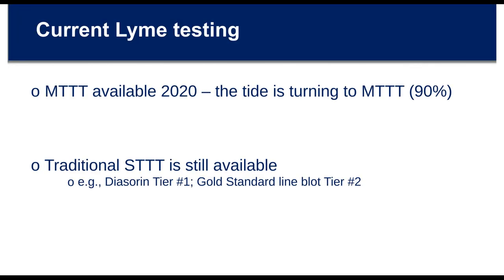So, current Lyme testing. I'm speaking to you now, as you saw from my biography up front, as someone who works for the Northeast Division of Sonic Labs, which is basically in New York and Rhode Island. We introduced the MTTT in our lab about a year ago, and 90% of our volume of Lyme serologies are now MTTT. Traditional STTT is still available, and there are multiple options on what you would like to use for the first tier and what you would like to use for the second tier.